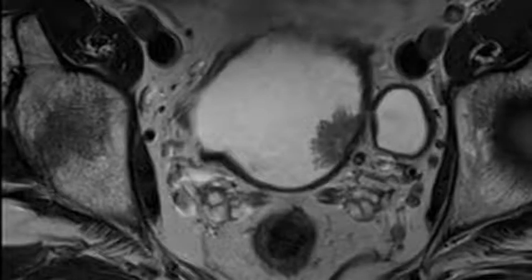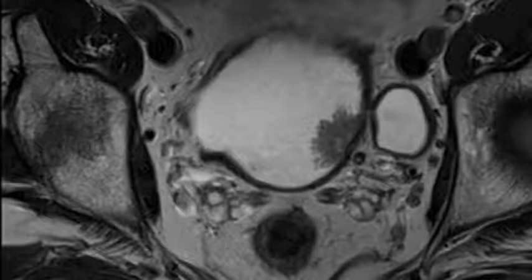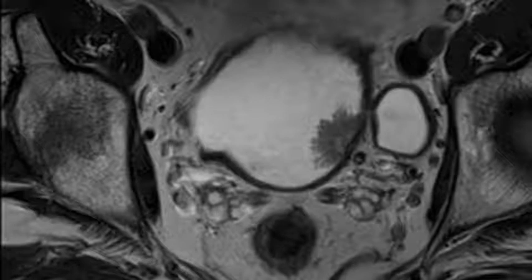Urinary bladder cancer imaging considerations. Computed tomography. CT urography has a sensitivity and specificity of over 90% for the diagnosis of bladder cancer in patients with hematuria. In patients who are at low risk for cancer, such as those less than 40 years of age or female non-smokers, CT urography may be sufficient for detecting the presence of bladder cancer.